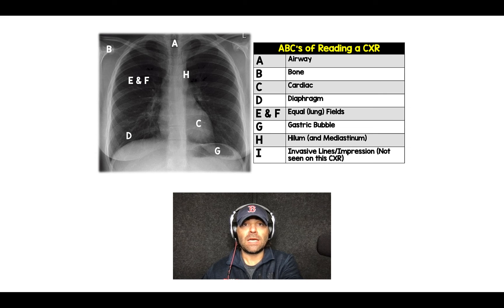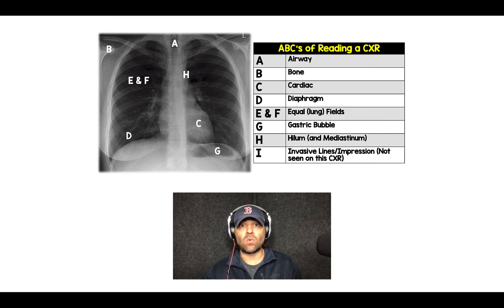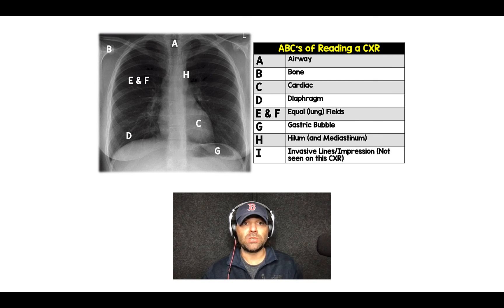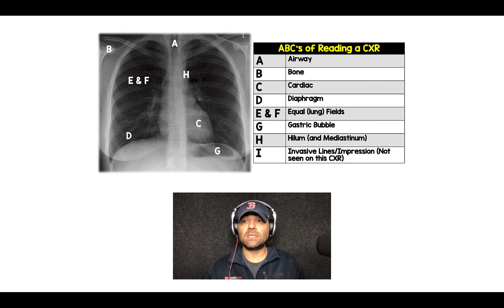And finally, the last thing — which I don't have on this chest x-ray — is the I, which stands for invasive lines. This chest x-ray doesn't have any central lines, dialysis catheters, or nasogastric tubes to point out, but that would be the last component. And so there you have it — that's the ABCs of reading a chest x-ray.